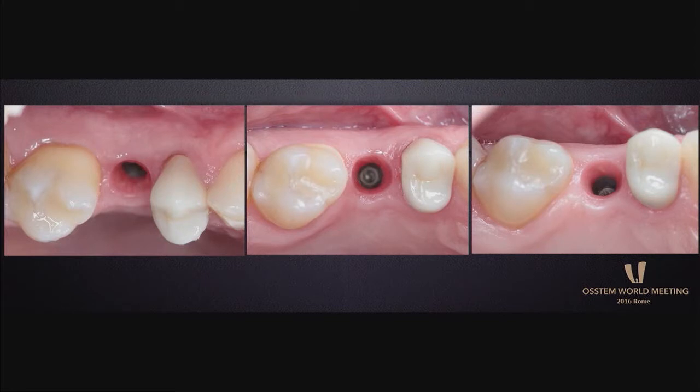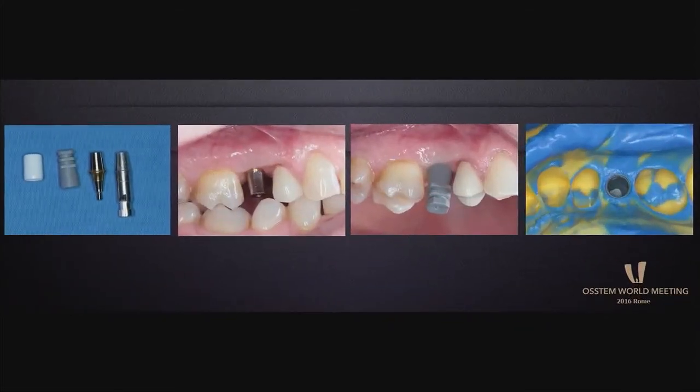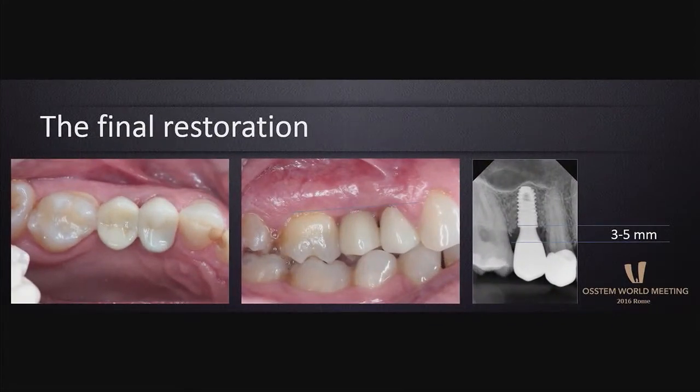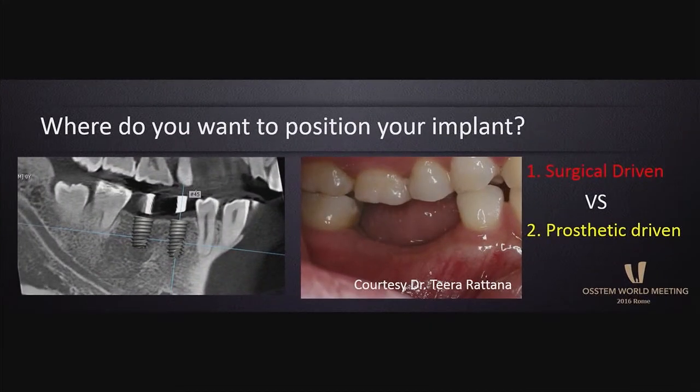You can see the good soft tissue profile around this implant, which will be a good biologic width to protect against bacterial invasion in the future. Now we connect the abutment, take the final impression, and make the final restoration for the patient. With a good installation depth, the marginal bone will be well maintained around the implant body, and this will give good long-term mechanical stability.